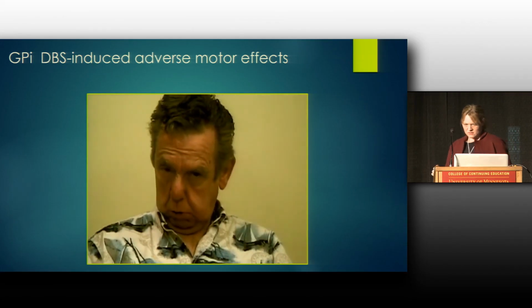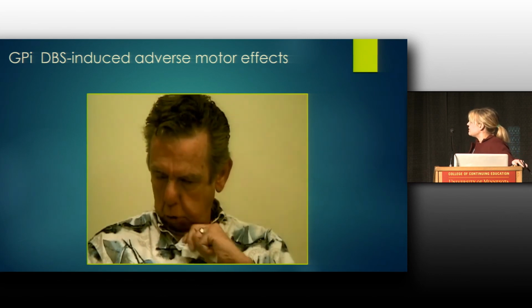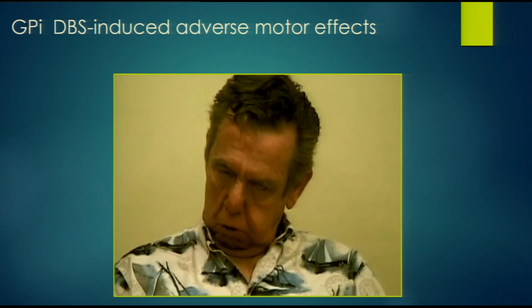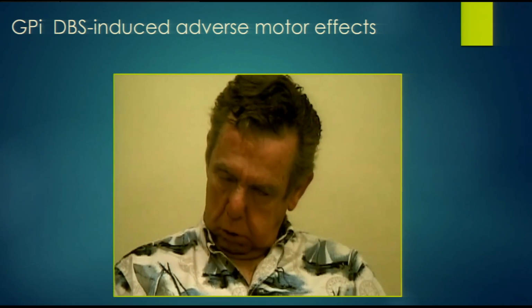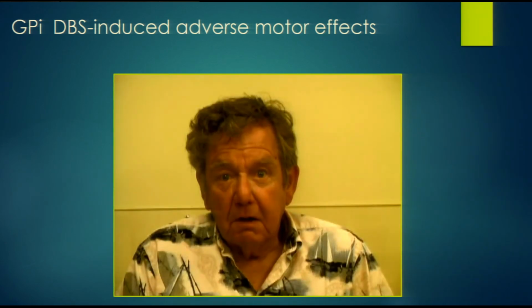Cervical dystonia is evaluated preoperatively. On exam, he has prominent blepharospasm, oromandibular dystonia, anterocollis, and laterocollis. The rest of his neurologic exam was normal, except for some mild truncal dystonia. 3 years following bilateral GPi DBS, stimulated chronically at 185 Hz, the patient demonstrated continued improvement in his dystonia. However, he complained of decreased facial expression and generalized slowing.